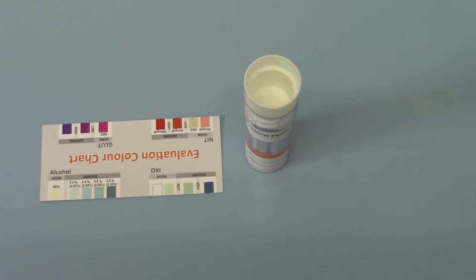We feel, in terms of the chain of custody and impact, it is better to run a procedure where you are running the test in front of the individual that you're taking the sample from, and that they are waiting with you while you wait for the interpretation of the results and running through it with them.